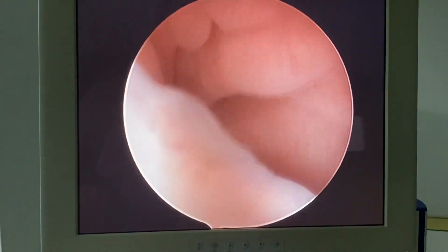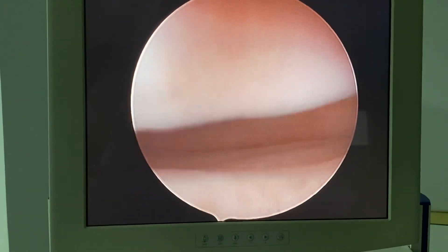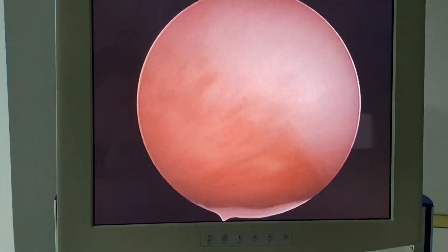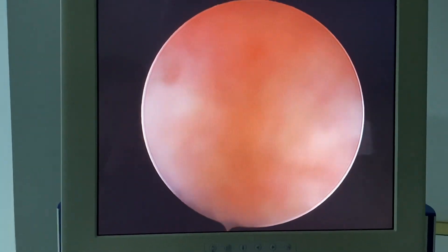The description of the technique in the article is that you glide the hysteroscope inside the vagina gently, trying to find the posterior fornix — that's the posterior fornix — and then pull back and try to see the external os. This is the external os, so this is classic vaginoscopy.